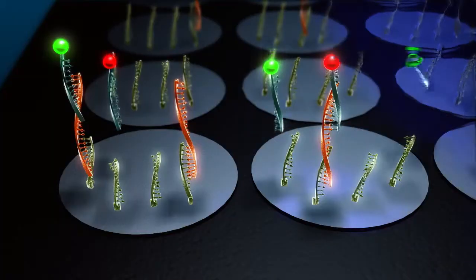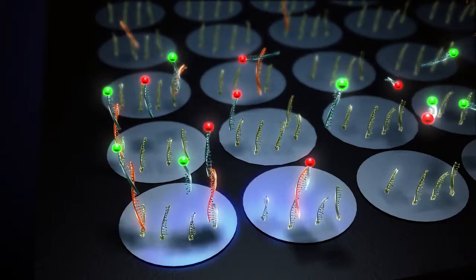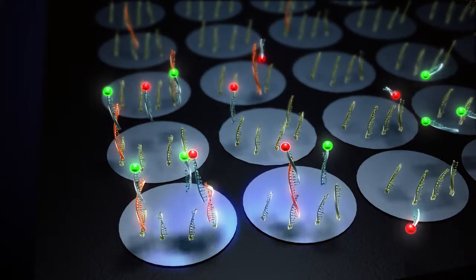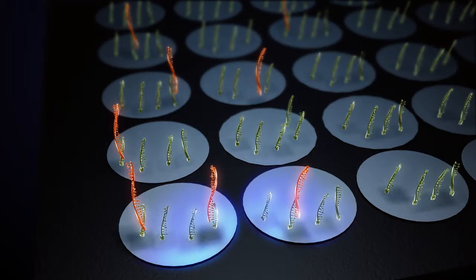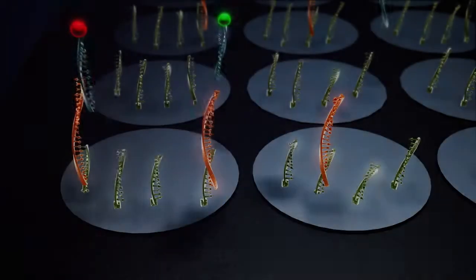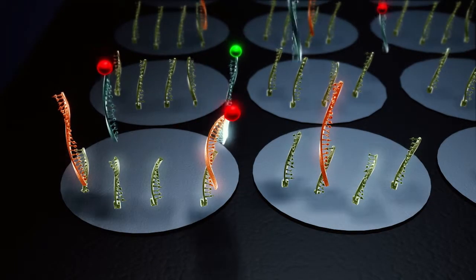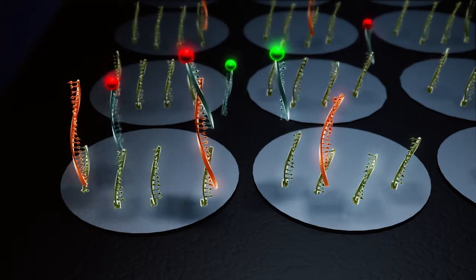Excess probes are washed away and an advanced imaging system detects the bound reporters at different wavelengths. After image acquisition, a thermal stripping process removes the reporters while leaving the amplicons in place. A new set of reporters is applied and the process repeats as many times as required for each specific application.